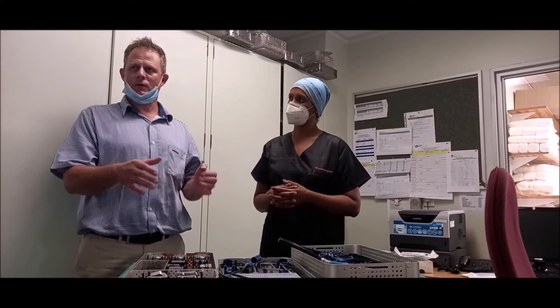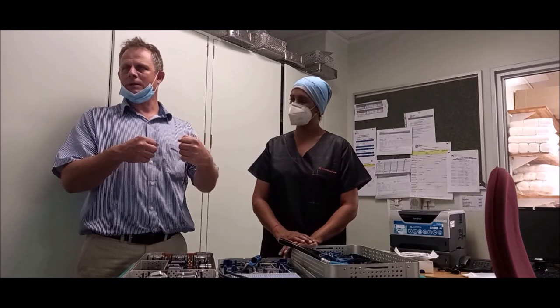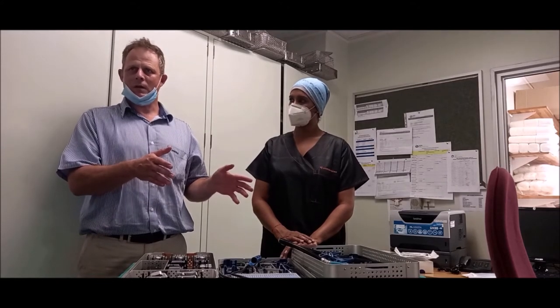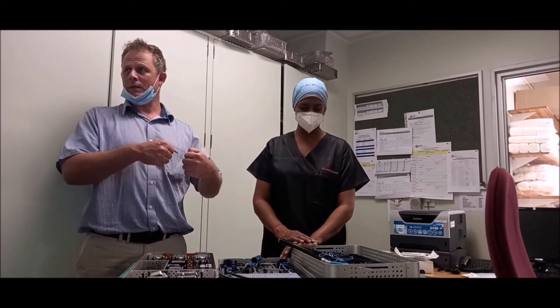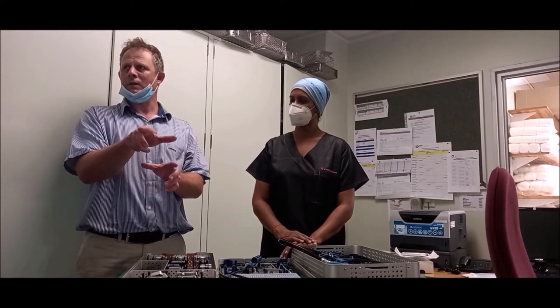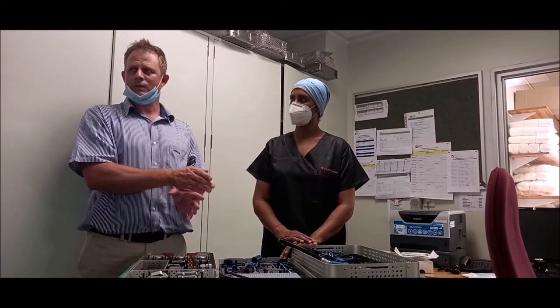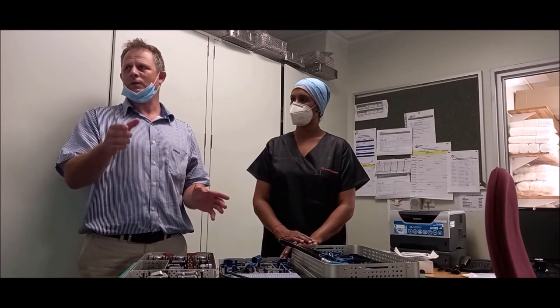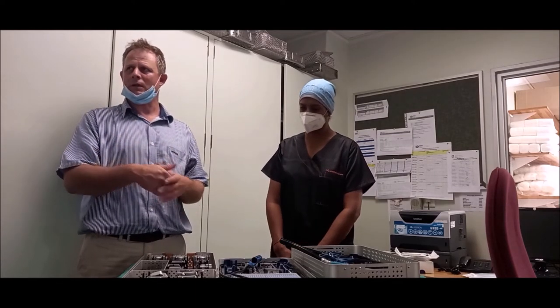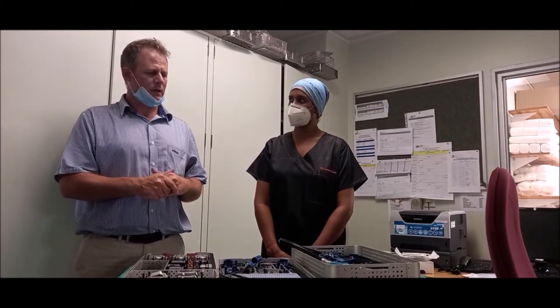Knee replacement is all about soft tissue balancing. If you put your knee in incorrectly, your soft tissues are unbalanced and patients do poorly. Traditionally, the accuracy of soft tissue balancing in knee replacement means about 85% of people are happy, and that 15–20% who aren't happy is because their knee is unbalanced. This system allows us to put in an implant as close as possible to the native knee, allowing all the soft tissue to be balanced. It increases patient satisfaction from around 80–85% to 95%. The goal of this robot is, firstly, accurate cuts, and secondly, to give patients a better functioning knee and greater longevity — making it last longer.